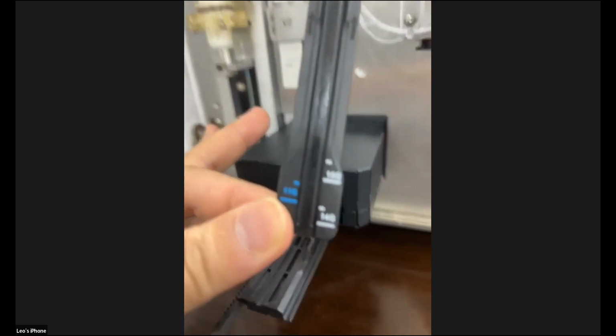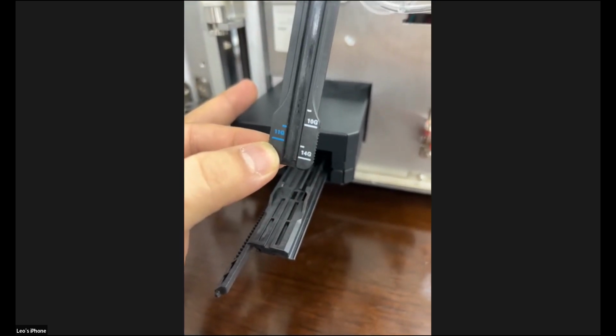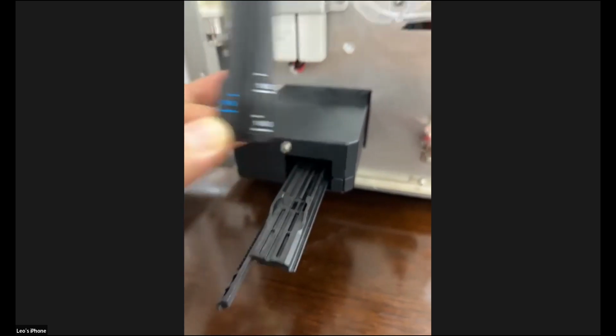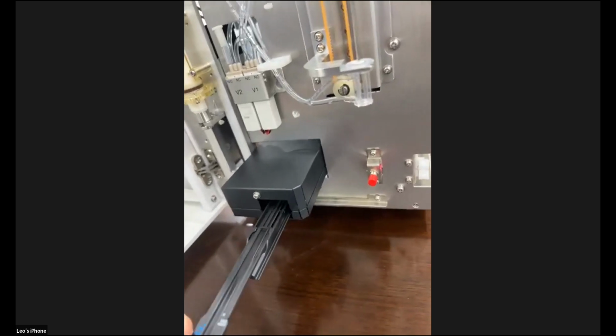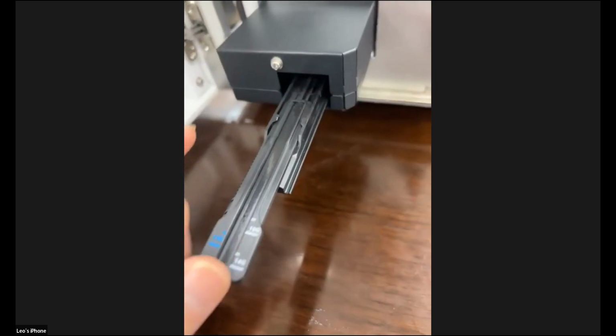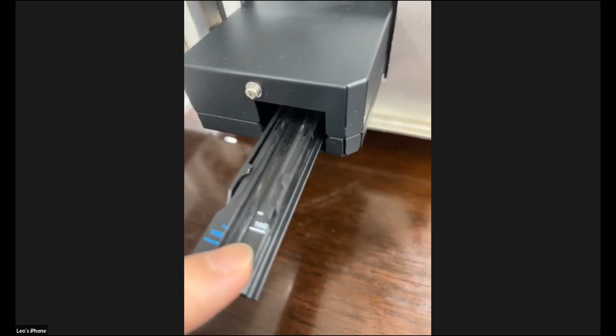Also, you can see from my view, there are different scales to mark the different types of strips you select. After cleaning, you can just push the slide into the strip holder.